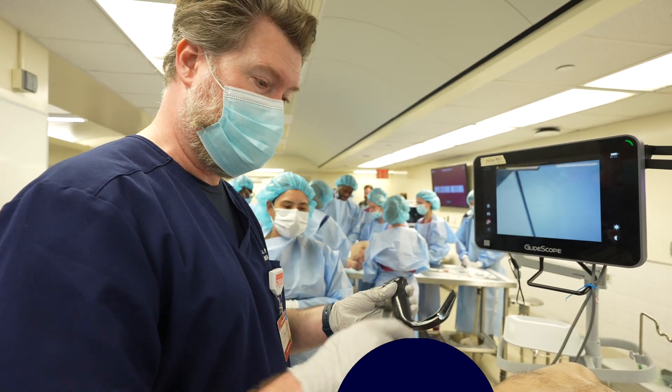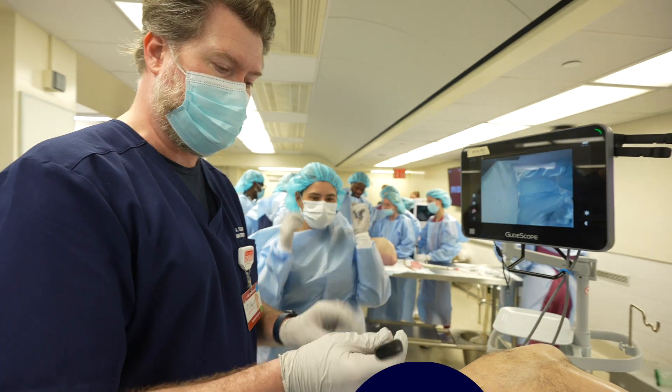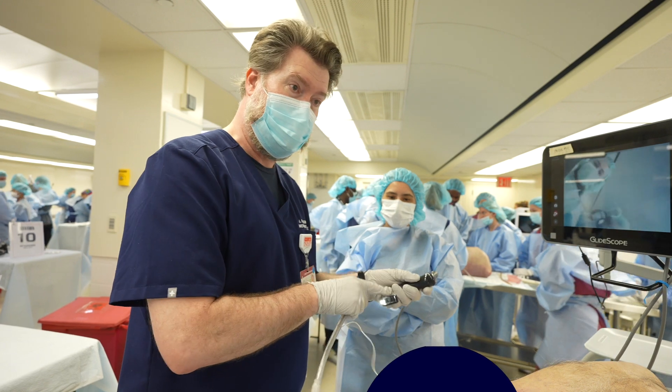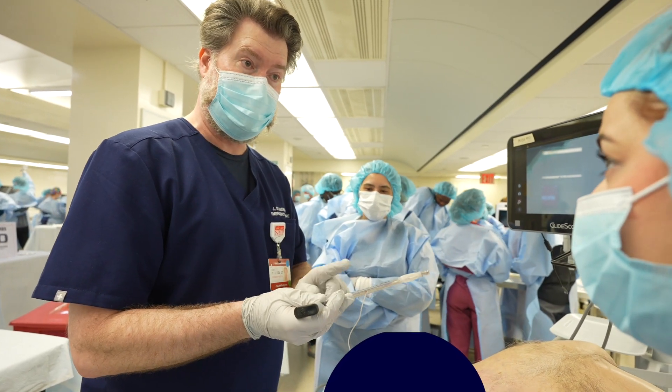We're going to do hyper-angulated blade with rigid stylet. What happens for a lot of people is they forget that the stylet is actually a device. They focus only on the blade, but there are actually a lot of skills that go with using the stylet effectively.